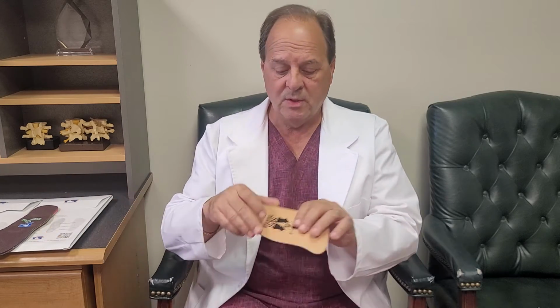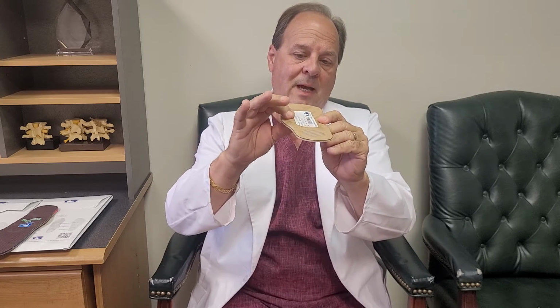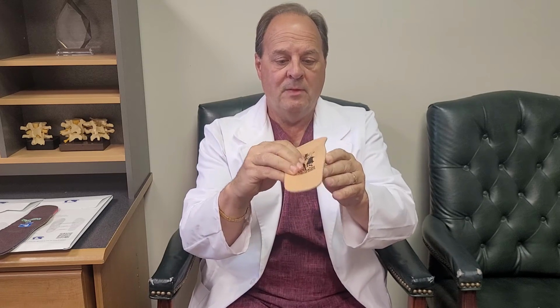Now, when you first put the orthotics in your shoe and you stand up, it's going to feel like somebody put cotton in your shoes, like little bumps. When you first look at the orthotic, you'll go, well, it doesn't look like it does much. When you look at the bottom of it, most of the actual prescription is coming out of the bottom of the orthotic. So what you have to do is wear it for a few days, and all this bottom part will flatten out, and the prescription will actually stick up through the top. You have to break the orthotic in so that your foot gets used to that feeling of those little bumps, and also so that the orthotic can change its shape.